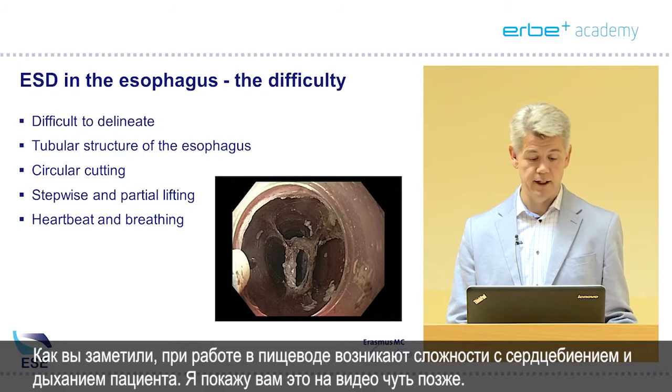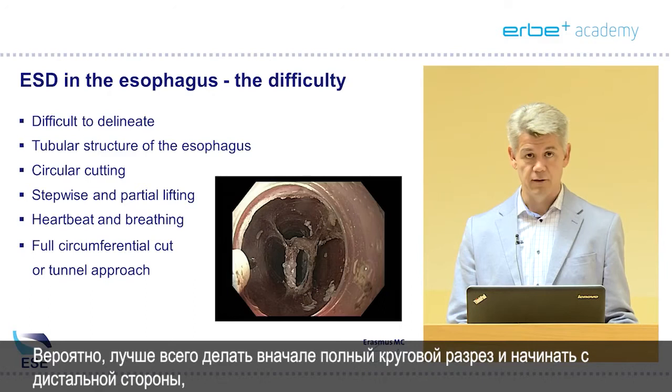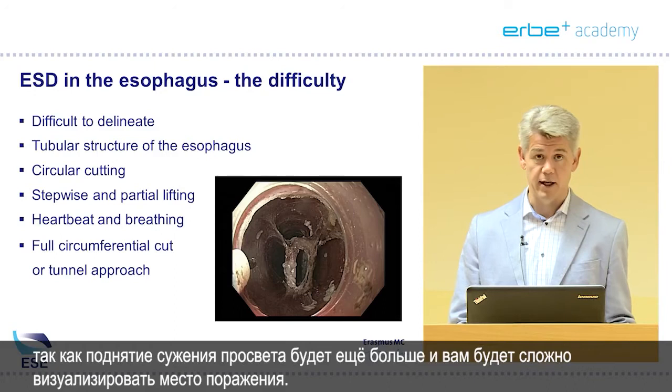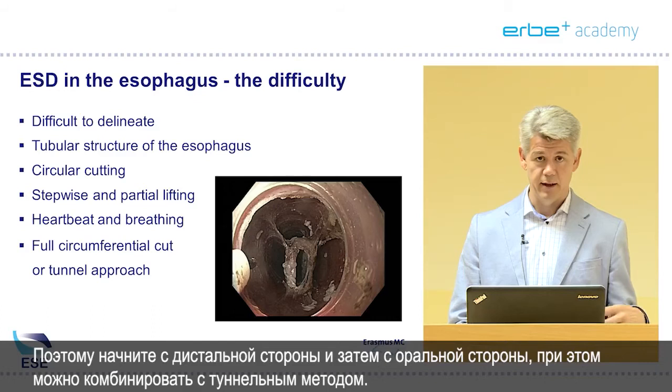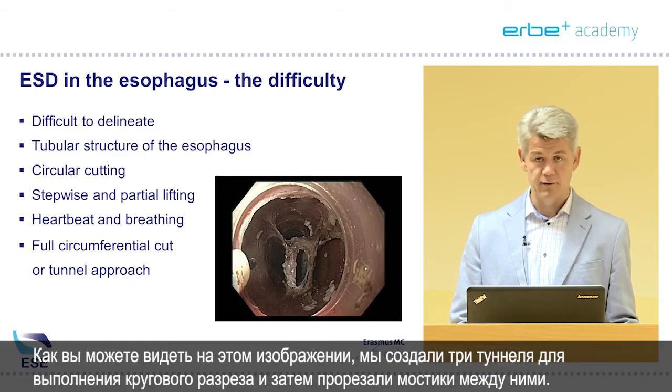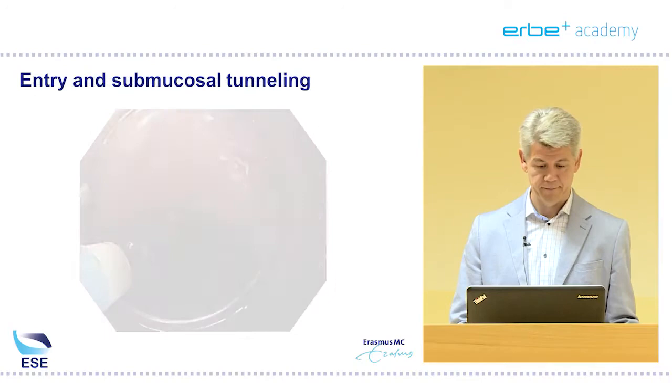I will show you in the video. It is probably best to do a full circumferential cut first and start from the distal side because of the lifting — the narrowing of the lumen will be even greater and you will have a hard time visualizing the lesion. Start from the distal side and then from the oral side, and you can even combine that with a tunneled approach. Here you can see we created three tunnels to have a circumferential cut and then cut the bridges in between.